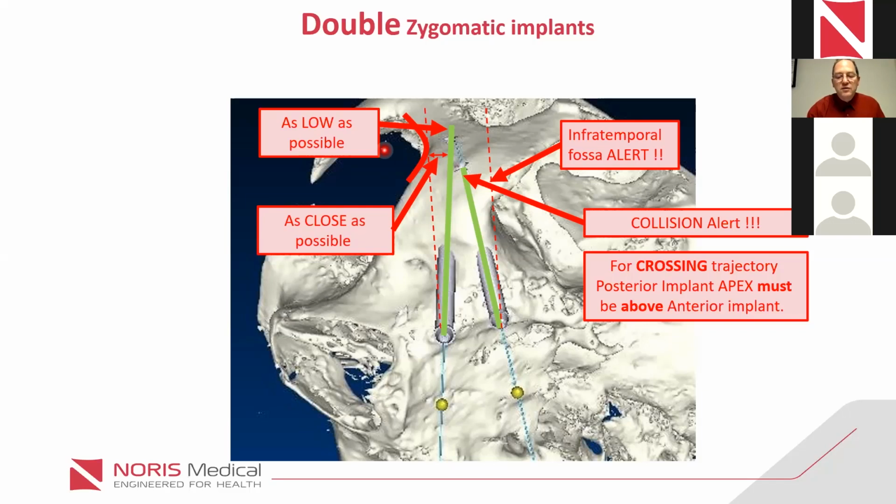When you put the diamond, let's say you decided to put the diamond this way. For the understanding, this is what you wanted to have. This is what you plan to have. An implant, the green implant, okay? This green implant has a distance from the tip of the mountain here. When you look from here, this is the angle that you're looking. It's like a train coming into a mountain to a tunnel, and you want to go out at a certain point. You don't see from where you're looking where you're going to go out.